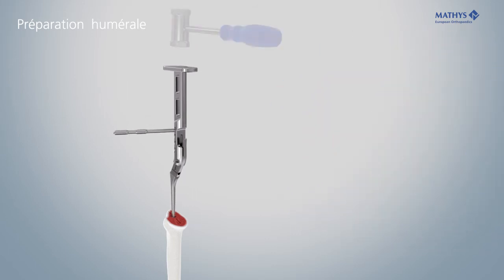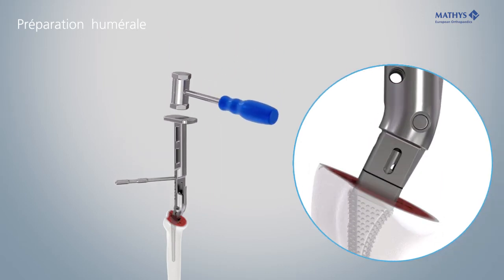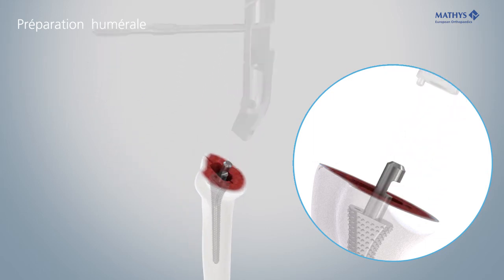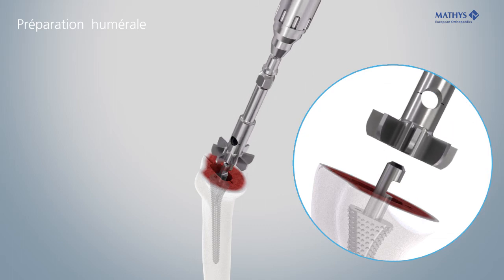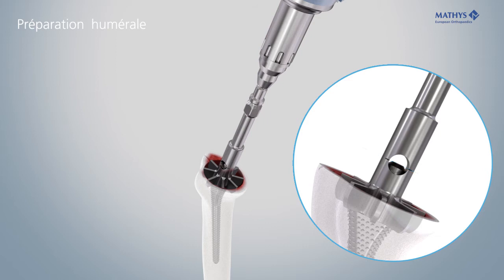Gradually rasp open the medullary cavity. The correct depth has been reached when the laser marking on the positioner is in line with the resection plane. With the humeral reamer 1, the proximal part of the stem is reamed via the inserted rasp.